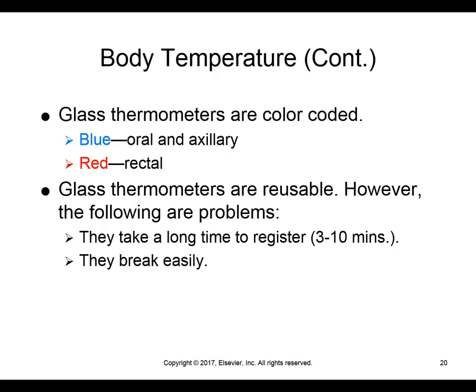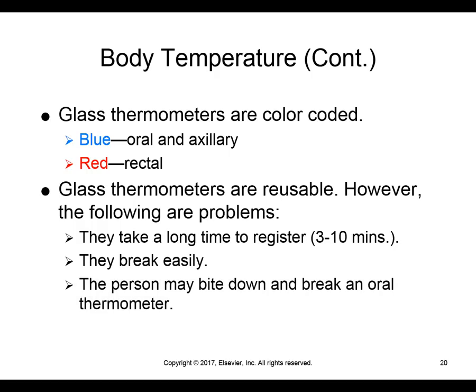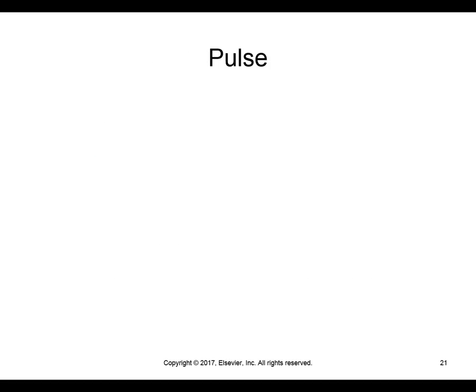But it's glass, so it can break easily, and because of that, it can be dangerous when you have an exposed piece of glass that you might not have noticed the tip has been broken off. The person may bite down or break an oral thermometer, which would be terrible. So generally, most places don't use them anymore.